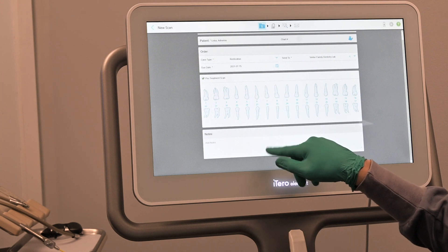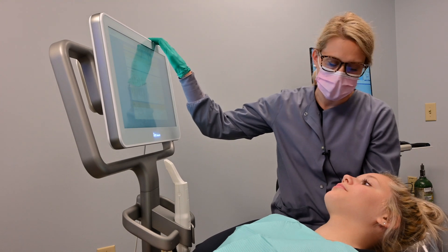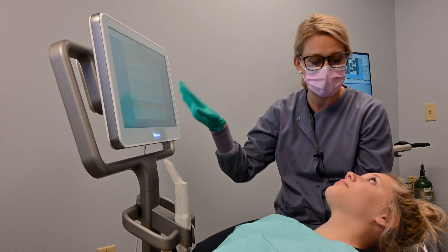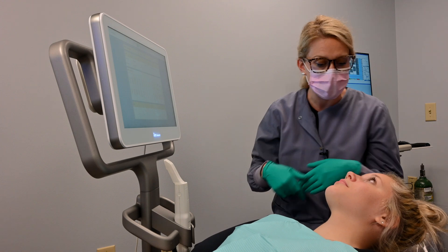We're going to get you scanned on both arches, upper and lower, and your bite for Invisalign. Once we're done getting your scan, we'll be able to submit it to Invisalign and they'll be able to pull up a simulation here for you to see where your before and after of Invisalign can give you an approximate estimate of where your teeth will rotate.